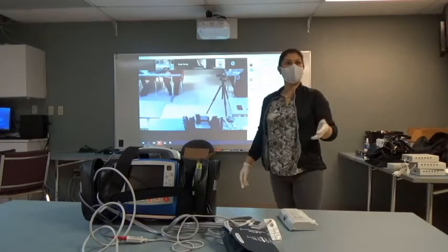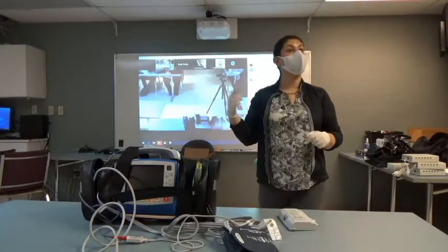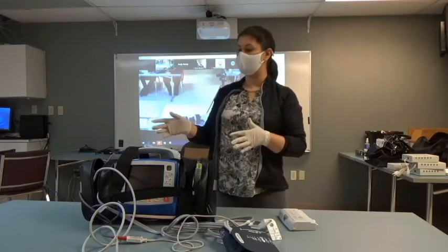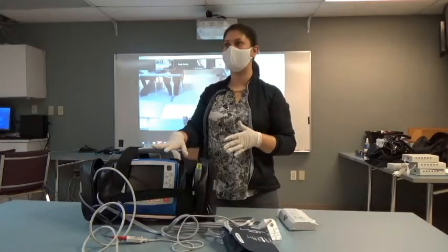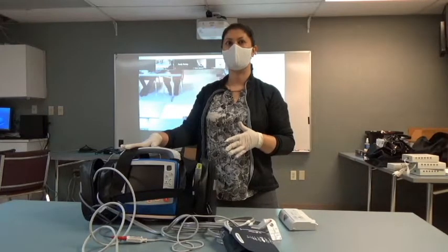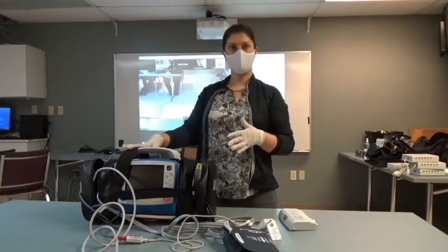For every minute that it sits on charge, you guys will get a minute of runtime off of there as well. I'm not sure what the plan is, if you guys are intending to leave these plugged in all day, or if you guys have thought about that yet. We're plugged in, so I think we technically leave them. I mean, at least for right now, we have more options to leave them.